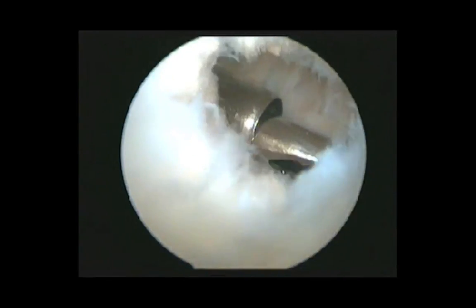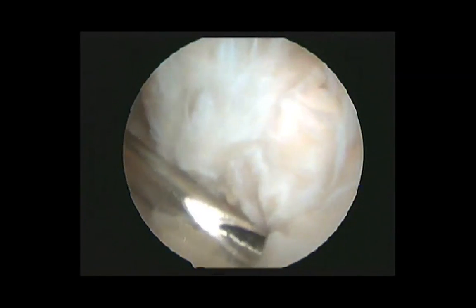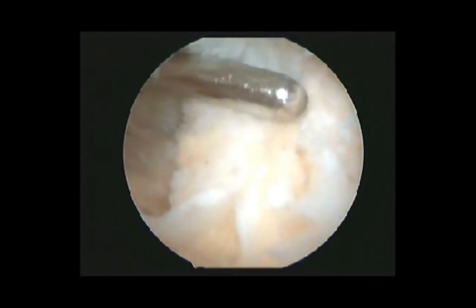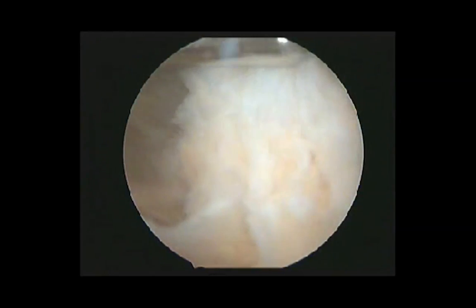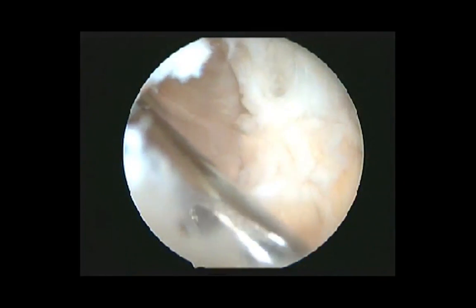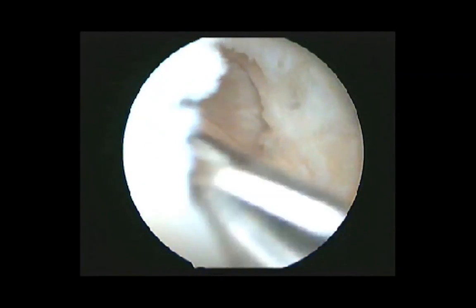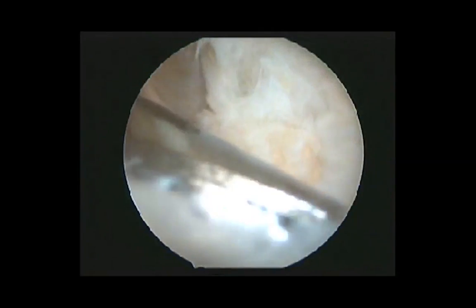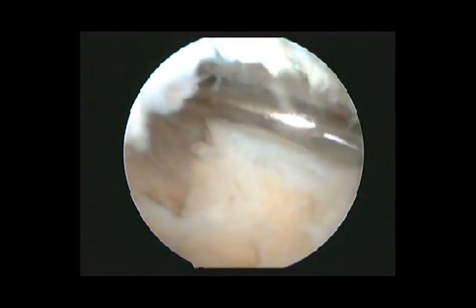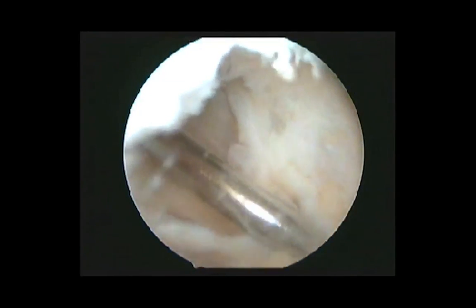As expected, the posterior compartment is filled up with the cyst wall and lots of fibrous tissue. This appearance is in contrast to a normal healthy posterior compartment, which is lined by a shining capsule posteriorly with the femoral condyle and tibia visible medially and laterally. We decompress the cyst anteriorly so as to create some space in which we can work posteriorly. Had we not decompressed the cyst anteriorly, it would be very difficult to create a space in which the shaver and camera can work. We are now debriding the fibrous tissue and cyst wall in the posterior compartment.